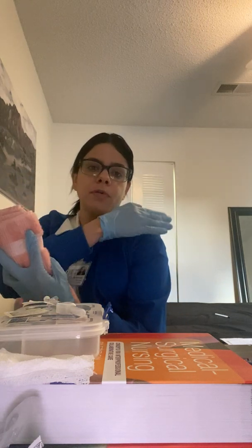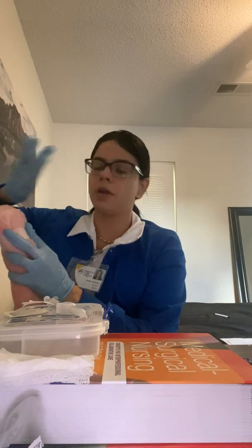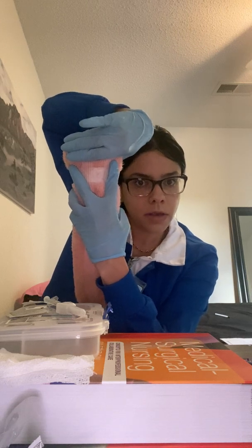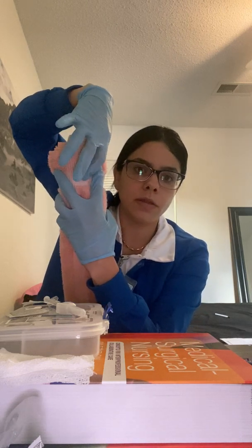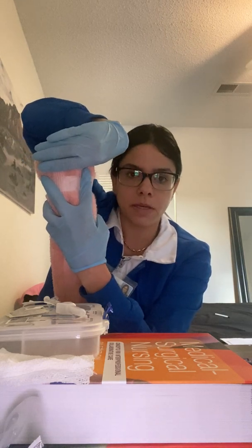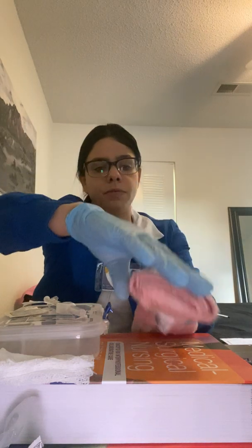And from the acromion process, which is here, I'm going to have 3 to 4 fingers down, and then you're going to see that there's a space right there, and somewhere in the middle, that's where I'm going to be injecting my medication. If I had my own arm, I would put my 2 fingers right here, and then 3 fingers down, somewhere in between, right there in that muscle. That's where I'm going to be injecting.